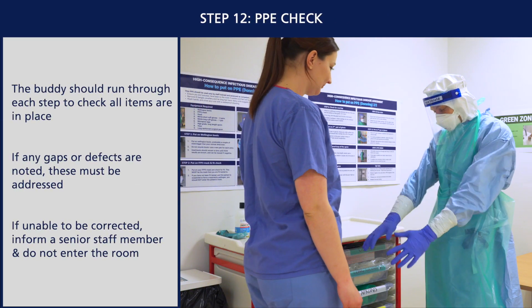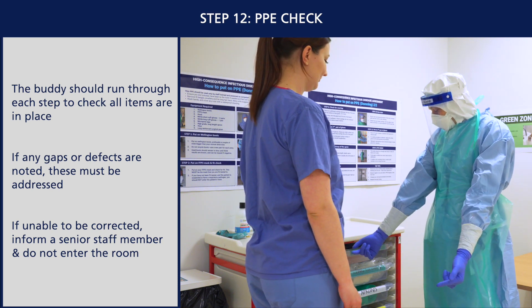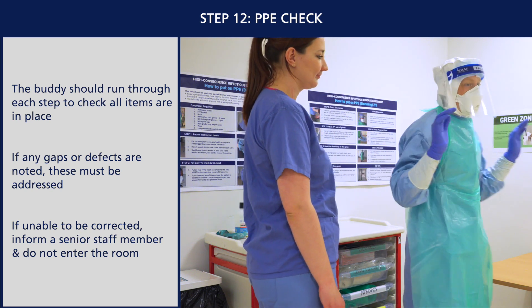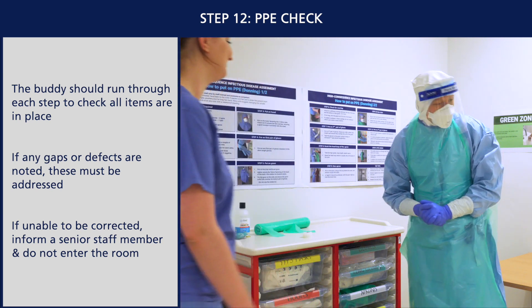The buddy should run through each step and check all items are in place. If any gaps or defects in the PPE are noted, these should be addressed. If this is not possible, do not proceed into the red zone. Once fully checked, you are now ready to enter the red zone.